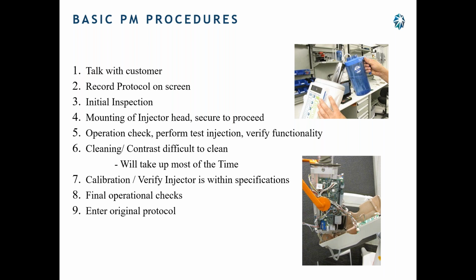Cleaning, this is going to take most of your time. Clean, clean, clean. Take the covers off and clean. A clean injector is a happy injector. Calibration verification, injector is within specifications.